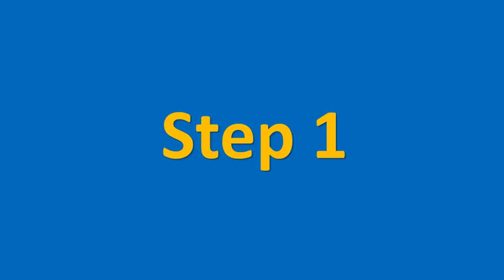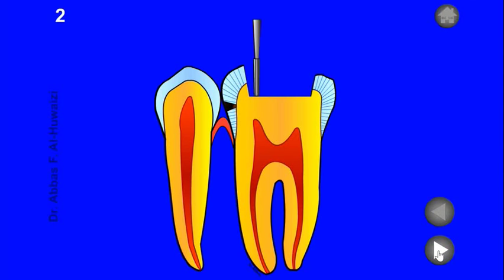Step 1: Place the Fissure Burr at the pulpal floor of the Class 1 cavity, then move the burr towards the carious side.